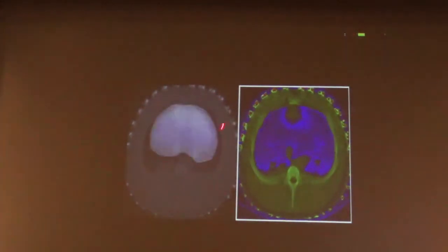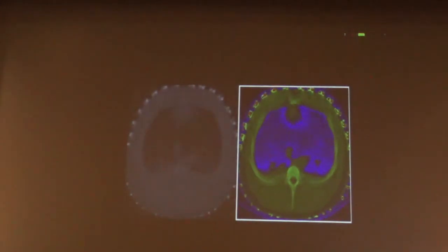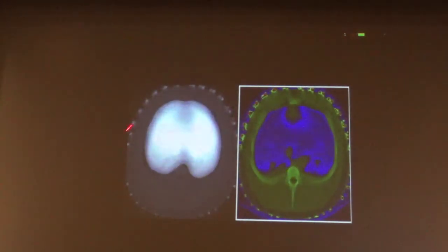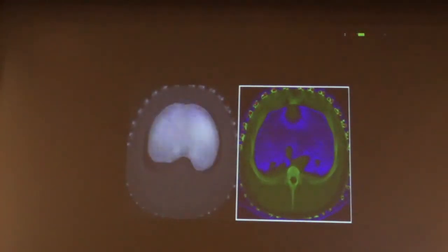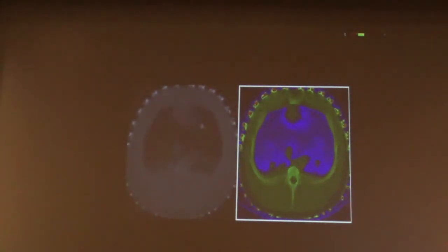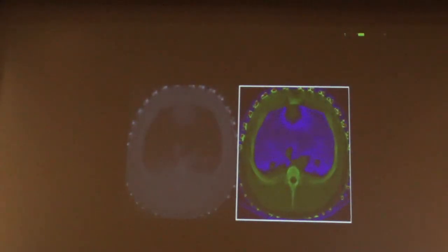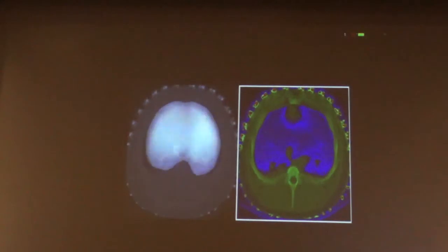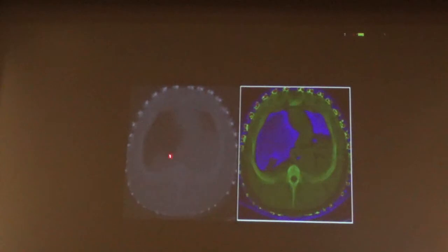We are taking information from something like 600 CTs, making a data bank, and then having this statistical information to help you to reconstruct the image. And by doing this procedure, you can see that you have a much more interesting image. It's not just like a bubble or a toy. You have really anatomical information. And for instance, in this particular animal, we could see that the match between CT and EIT was really remarkable just because of this anatomical information.